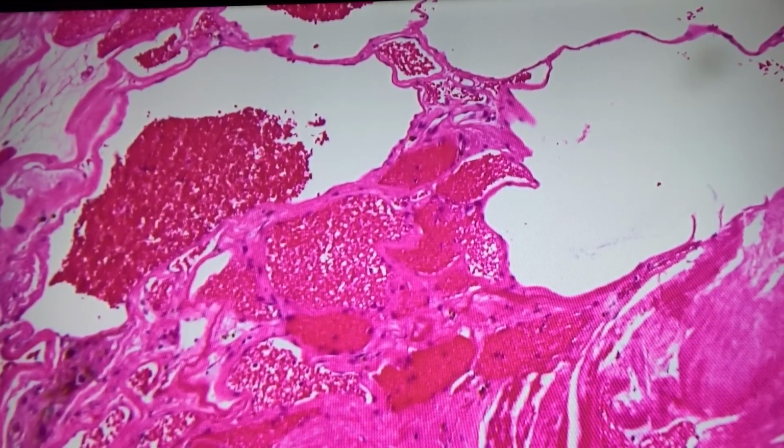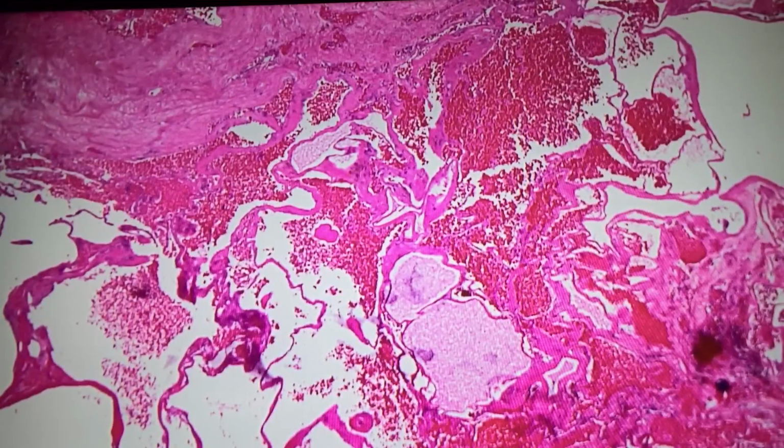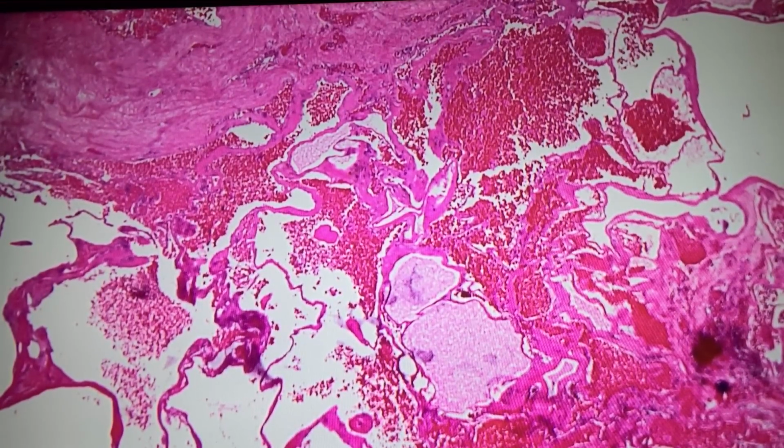I mean, it's basically the same family of lesions. I think on an AVM, what you want is a thicker feeder vessel, and then thinner vessels next to it, whereas this is all kind of one big vascular lesion. And AVM has intervening brain tissue between the vessels. Intervening brain tissue. Look, she's definitely absorbed her neuropath knowledge. Great tip, Josephine.